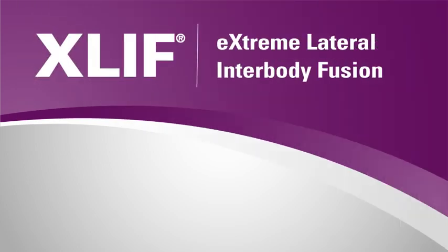XLIF, or Extreme Lateral Interbody Fusion, is a minimally disruptive spinal fusion procedure.